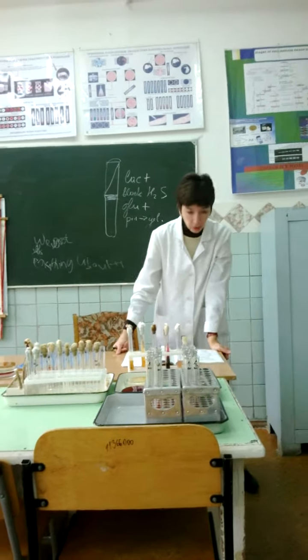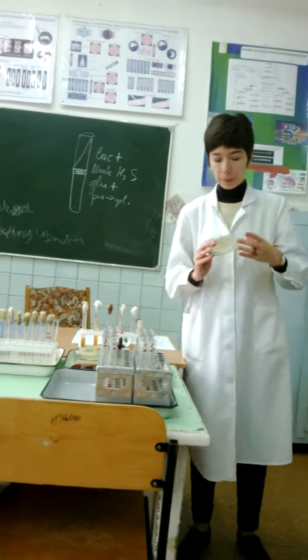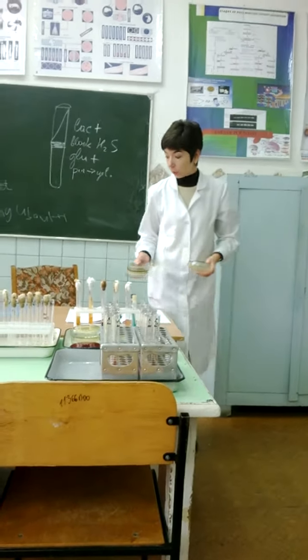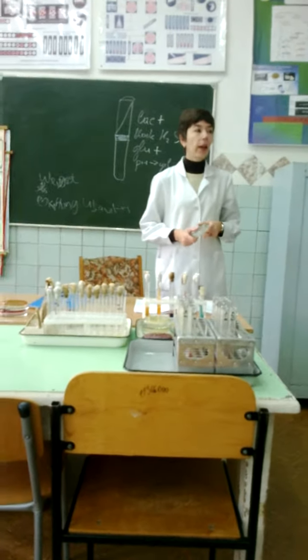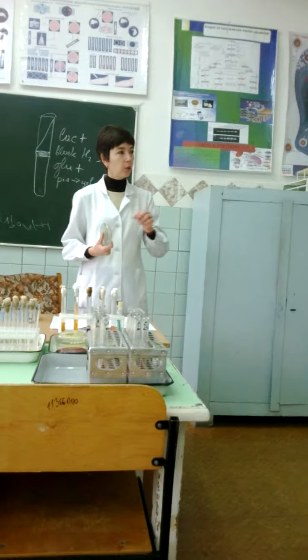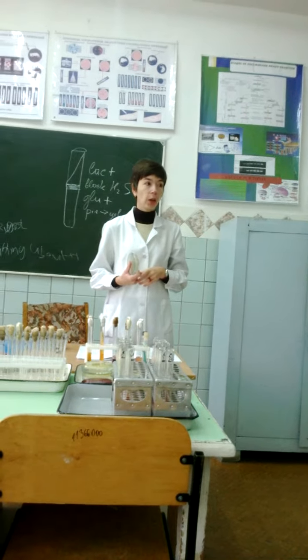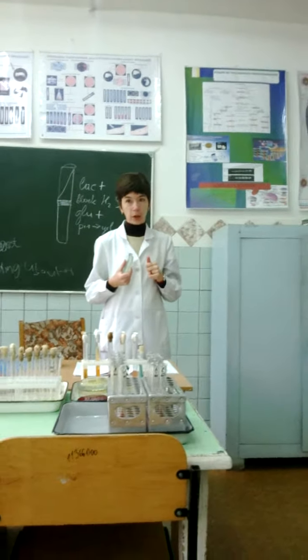Phage sensitivity tests, maybe today's topic also. Do you remember what a bacteriophage is? It's a virus which parasitizes bacteria. It has a very specific property: specific viruses multiply only in a specific group of bacteria, in one species and not in all species. A typical bacteriophage grows only in specific phagotypes of bacteria.